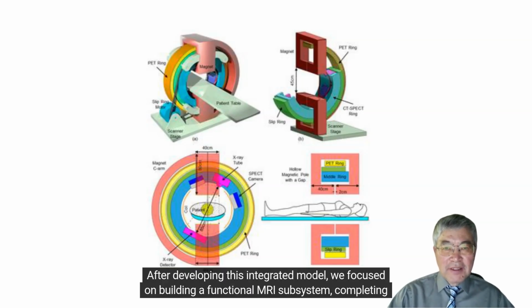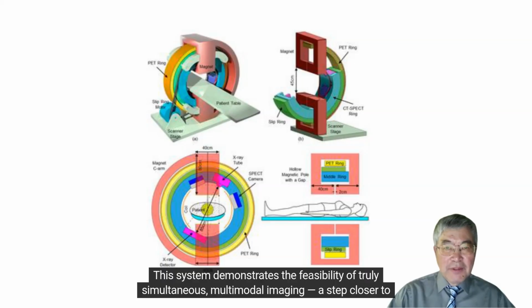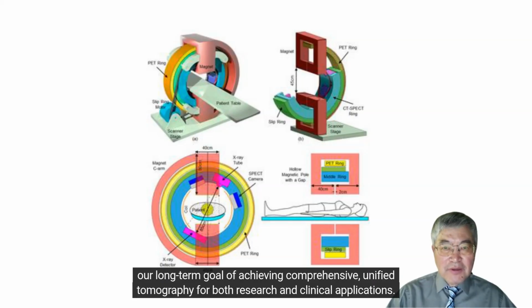After developing this integrated model, we focused on building a functional MRI subsystem, completing its design as a key step toward realizing a fully combined all-in-one scanner. This system demonstrates the feasibility of truly simultaneous multimodal imaging, a step closer to our long-term goal of achieving comprehensive unified tomography for both research and clinical applications.